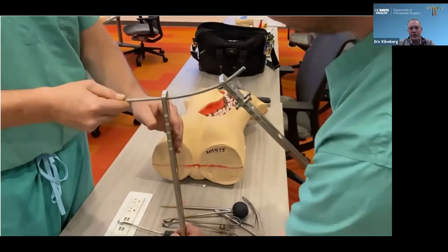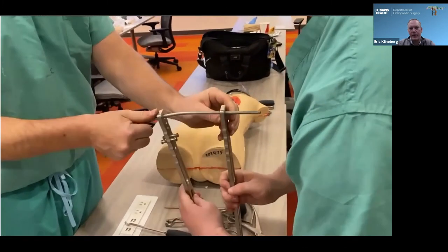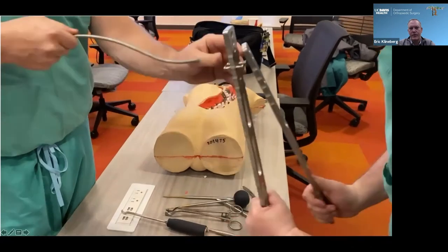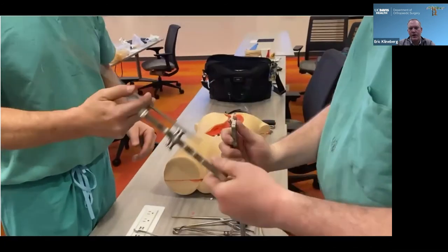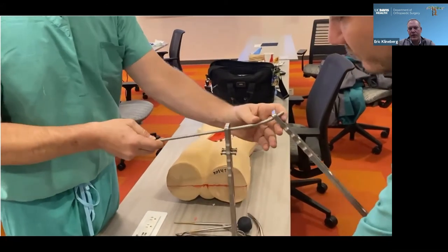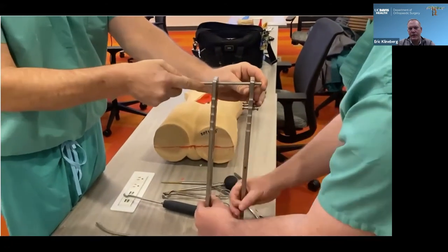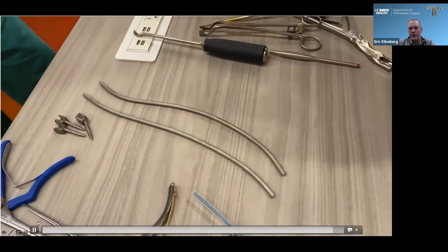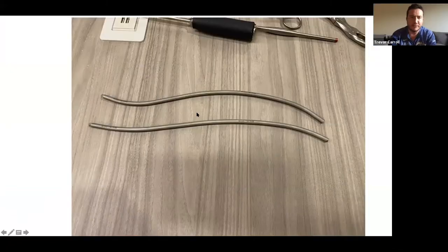So we do the proximal thoracic curve, and then we really give it a pretty good bend over that middle thoracic segment, and then some lumbar lordosis down there at the bottom where that nib is. And then this is the right rod. So same proximal kyphosis, but then we really want less kyphosis in that middle segment, leaving that pretty straight, just enough to gently tell it where to go. But you can see a huge difference in those two rod contours. So then there's the picture.